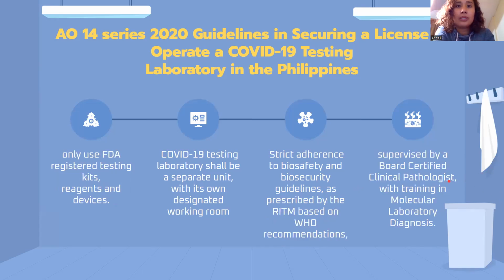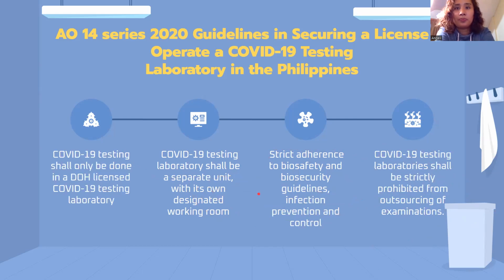It is strict. We only use FDA-approved kits, agents, and devices. We don't just buy from online shops, any agent. Make sure that they are FDA-approved. COVID testing shall be in a separate unit, supervised by a board-certified pathologist with training in molecular lab. So a pathologist is required.